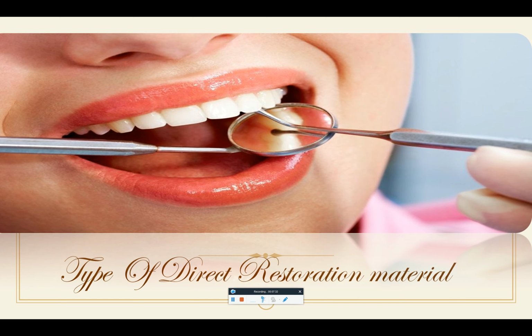One of them is A1, A2, A3, A3.5, and also B1, B2, B3, and we also have flowable and bulk fill. All these are composite and can be cured by light cure. And as I mentioned, there are types of composite that can be chosen depending on the color of the teeth in the patient's mouth. And second, GIC.